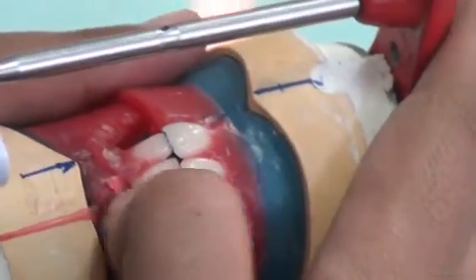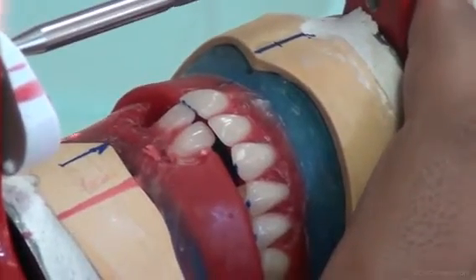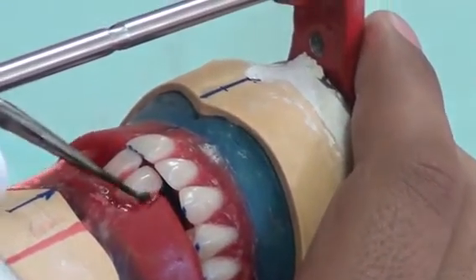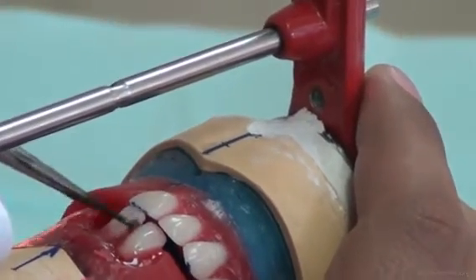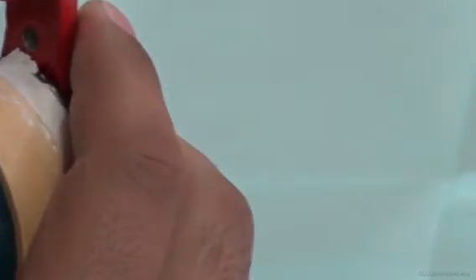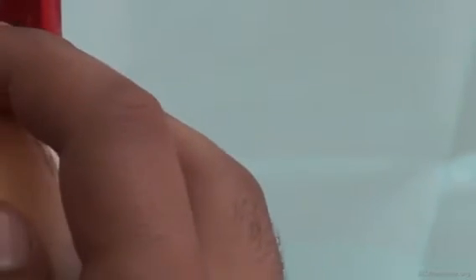Notice that for the lateral, this overbite has closed the space left by the upper lateral incisor. Remember, when we put the upper lateral incisor, we made it half to 1 millimeter away from the occlusal table. So when we did the overbite using the lower lateral incisor, we closed the space.